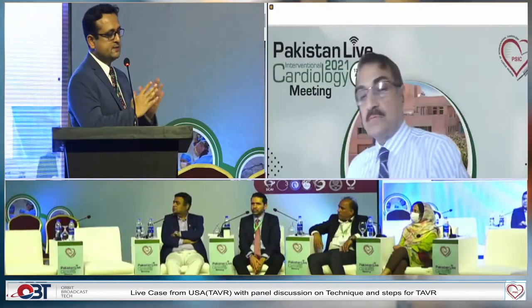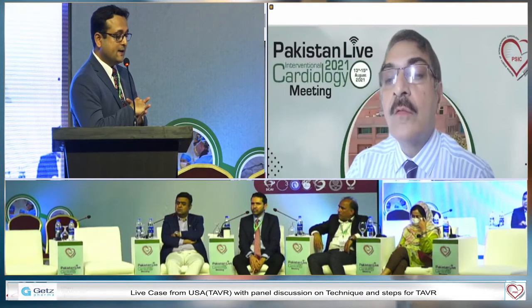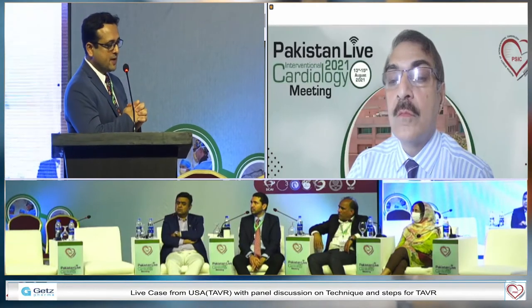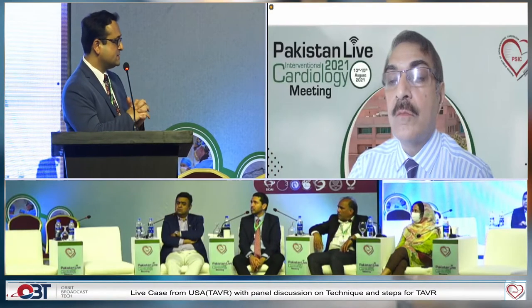Exactly. So it's a very valid point by Professor Noman regarding cerebral protection devices. There are multiple devices that are being trialed. The only one which is FDA approved is the Sentinel device, where you put these filters up into the carotids. Unfortunately, it did not show any MRI-based differences. But what they saw was, clinically, patients who had the Sentinel device put in to protect their carotids had lesser stroke. However, MRI-based data was similar.